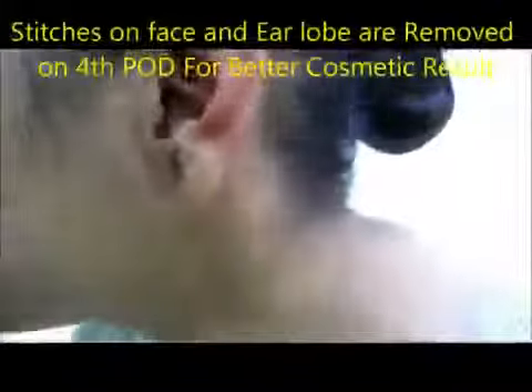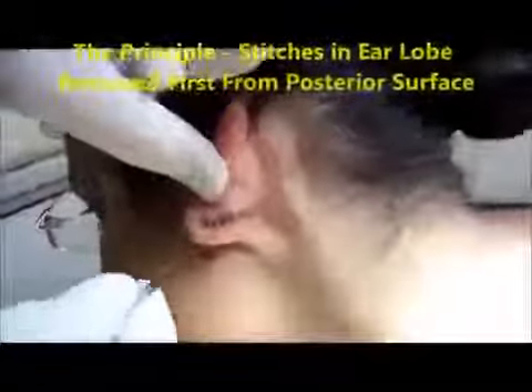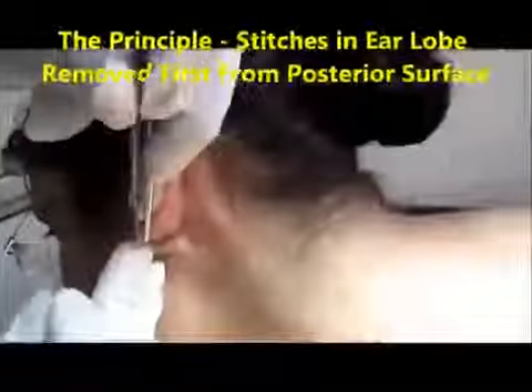That's why the stitch line is bigger in the posterior surface than the anterior layer. Now I am going to remove the stitches. Usually in the face and ear lobe the stitches are removed on the 4th post-operative day, as the healing is better in the face and for a better cosmetic result.